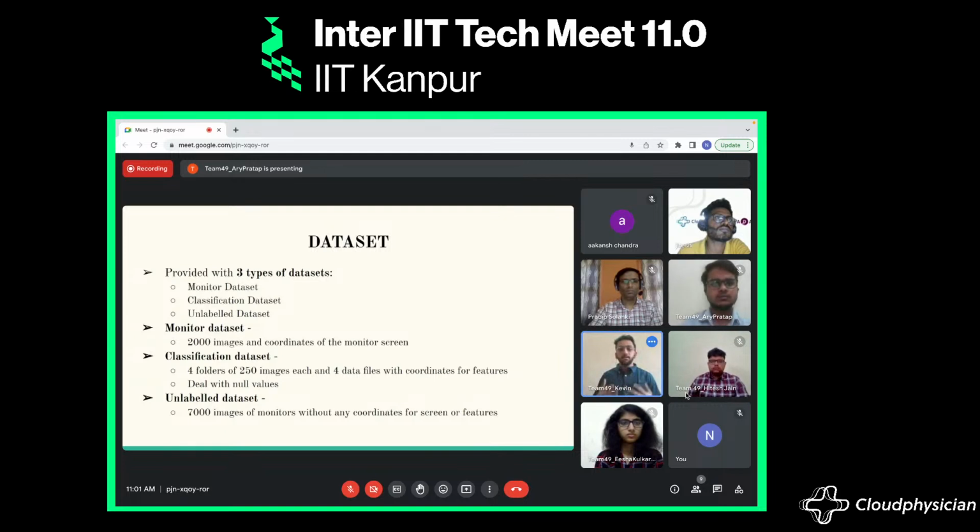Talking about the data set, we were given 3 types of data sets: the monitor data set, the classification data set, and the unlabeled data set. The monitor data set consisted of 2000 images, and we were given the coordinates for the same. In the classification data set, we had 4 folders, each consisting of 250 images, and 4 data files which consisted of the features of the 9 vitals of the human beings.